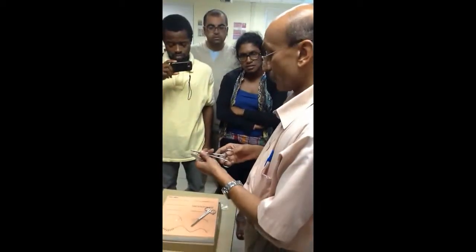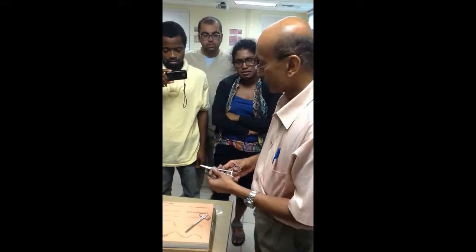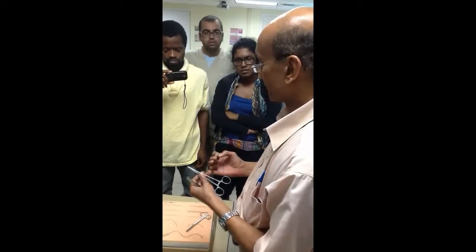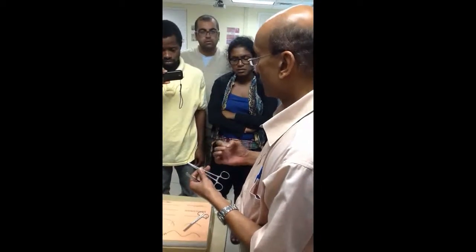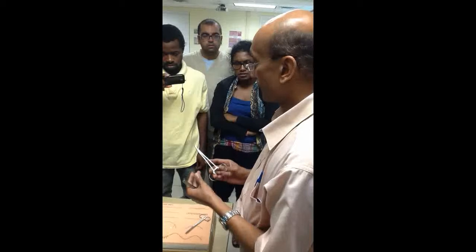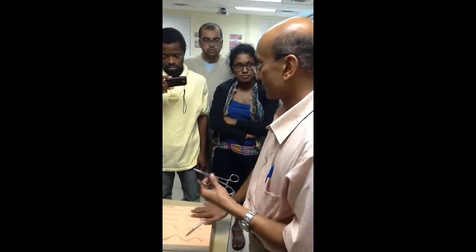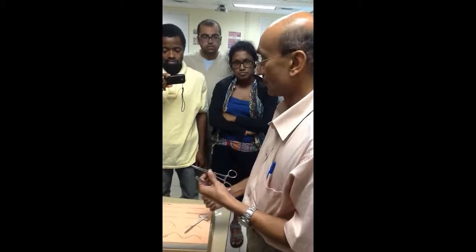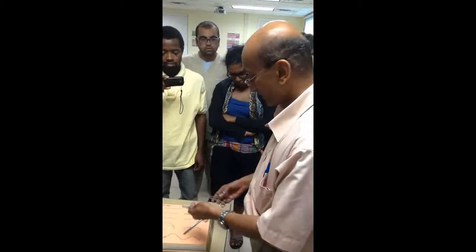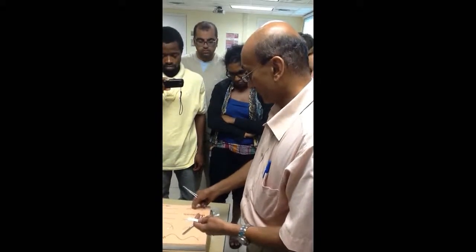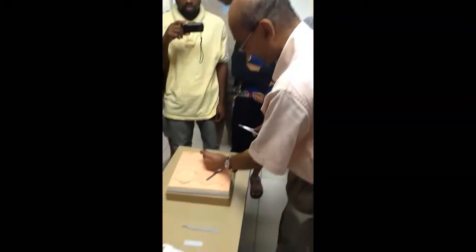When do we use a round-bodied needle, and when do we use a cutting needle? A round-bodied needle is used for delicate structures like peritoneum, mesentery, and intestine. A cutting needle is used for tough structures like the skin, the rectus sheath, and the linea alba. Since this material mimics the skin, we shall be using a cutting needle for this.